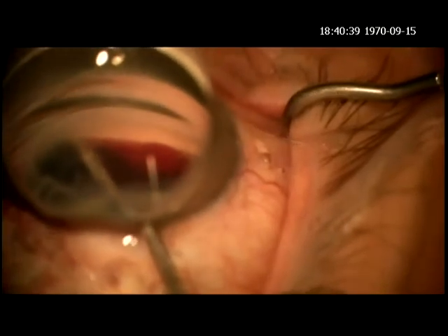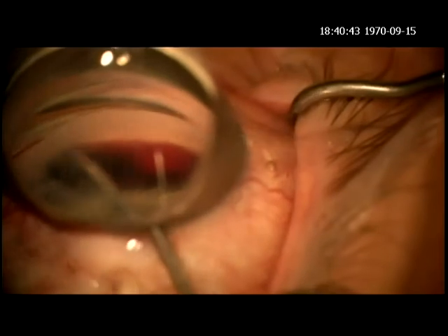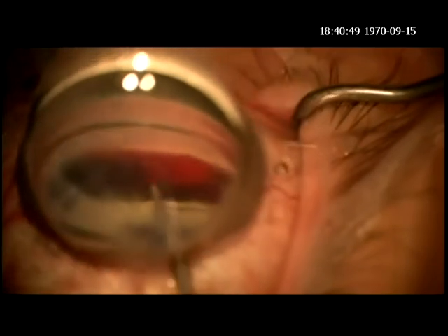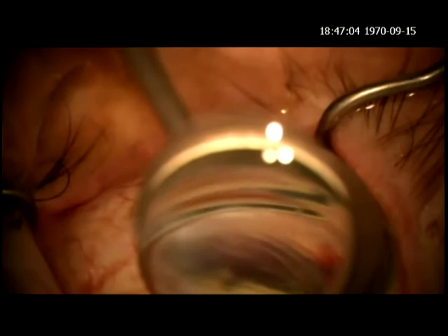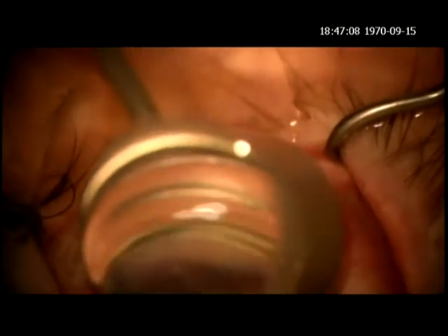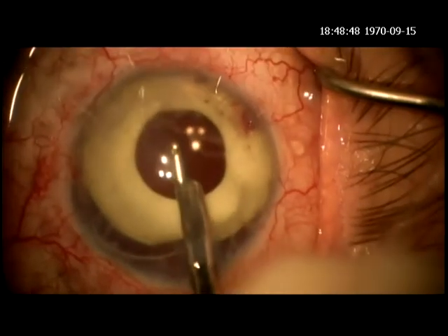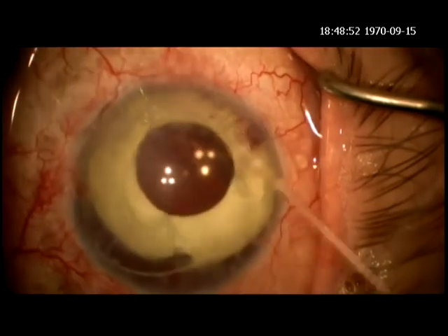Because we have created a completely new drain, and because we've removed the trabecular meshwork for a large area, I have no hesitancy in using my standard cataract postoperative regimen, which is cefuroxime 1 milligram intracameral and Kenalog 0.8 milligrams subconjunctivally. With the irrigation of the viscoelastic, you can see the Cypass in place at what would be the patient's 4 o'clock position.